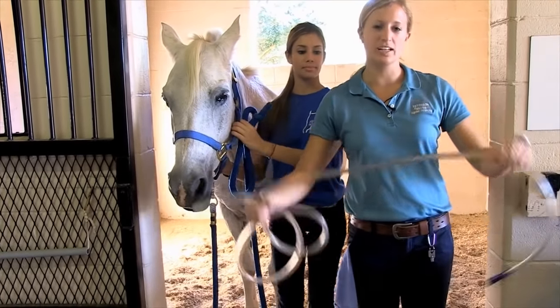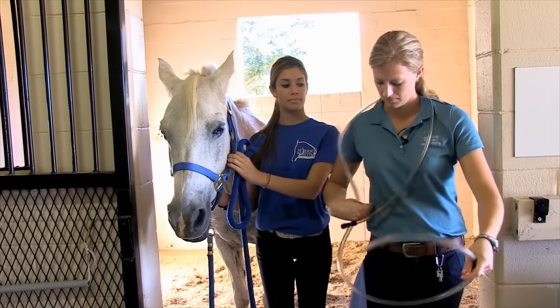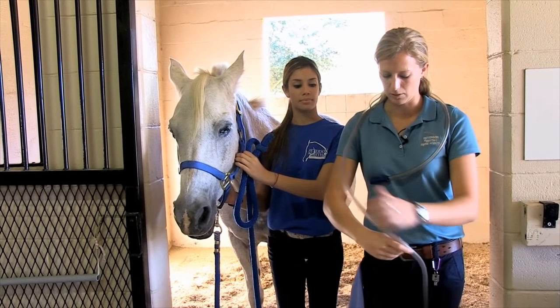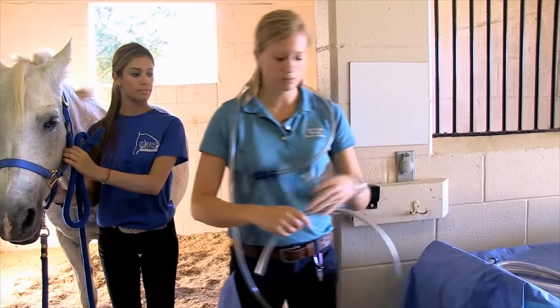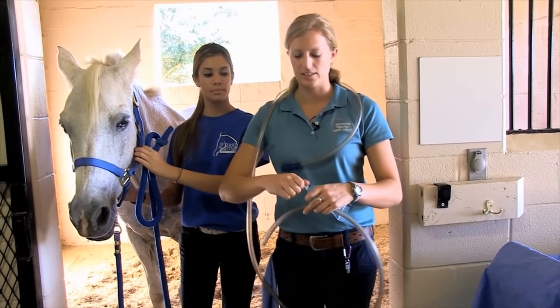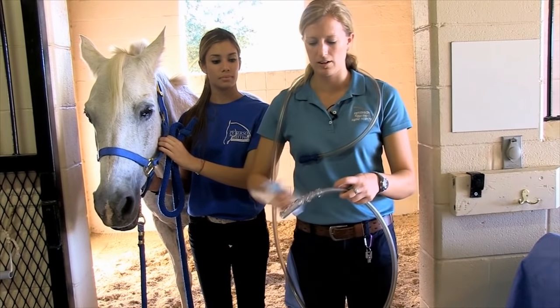I get the tube and put it around my neck just to get the kinks out of it a little bit. Then I grab some lube to make it pass easier through her nose, and just apply it to the end of the tube.